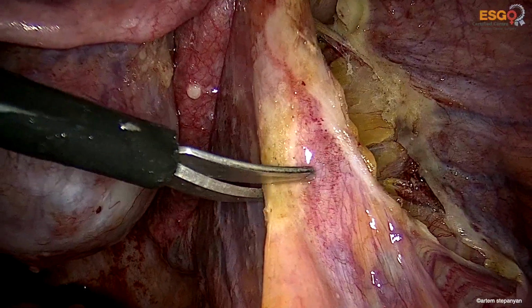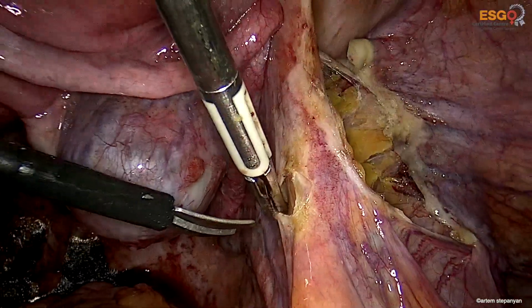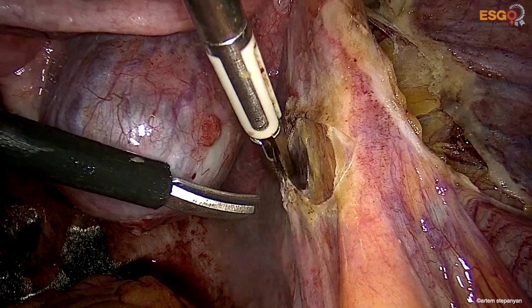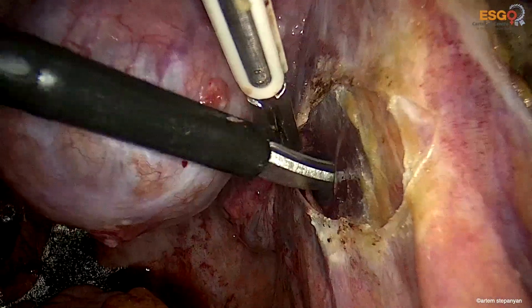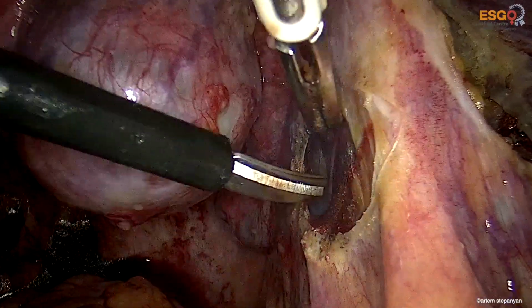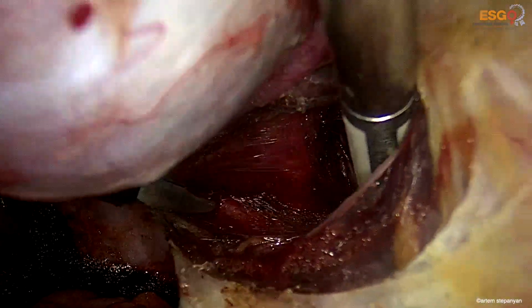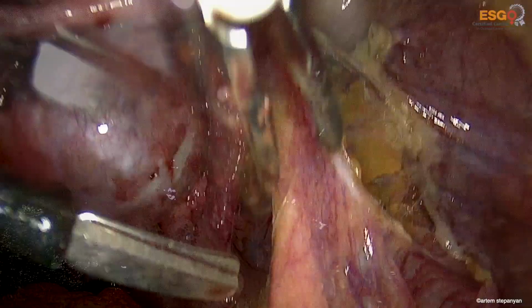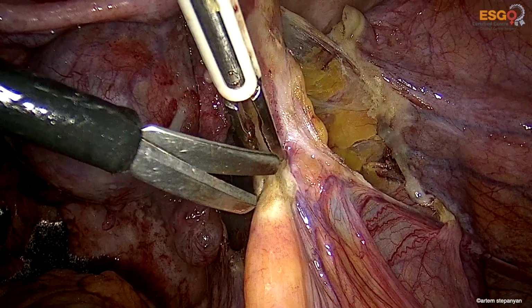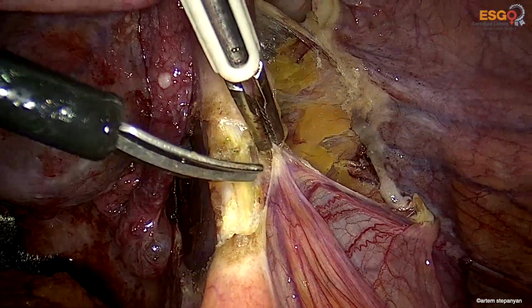We see the implants, and then we cut the peritoneum over the vessels of the IP ligament, and having all the retroperitoneal structures previously dissected and visualized, we can modify the extent of our pelvic peritonectomy in compliance with the number of disposition of the peritoneal implants.